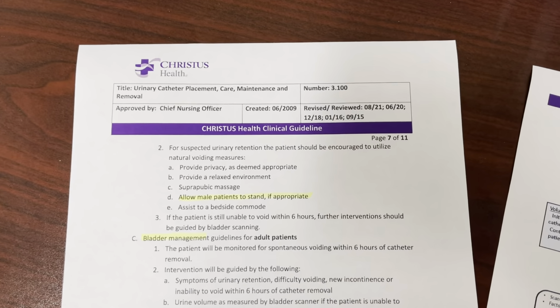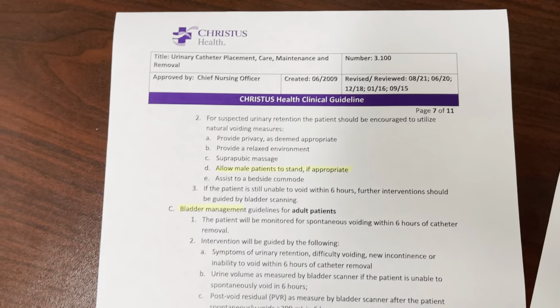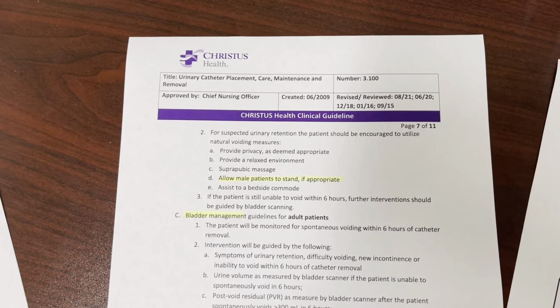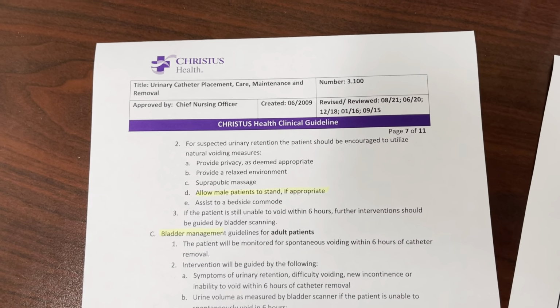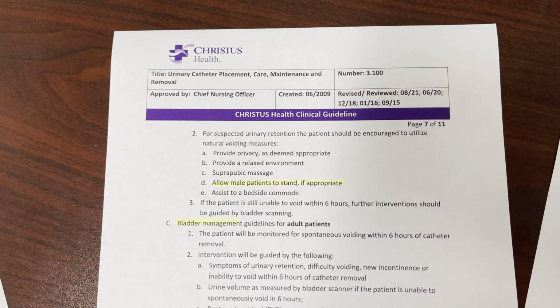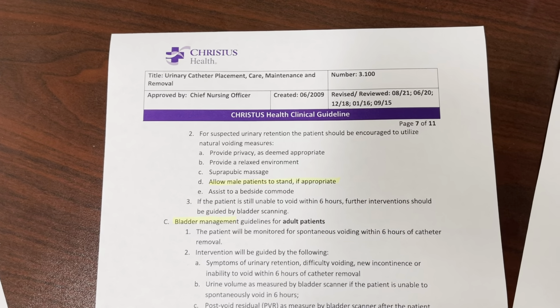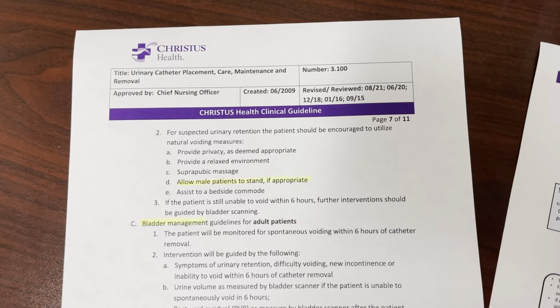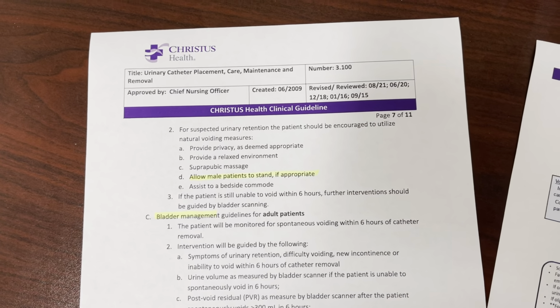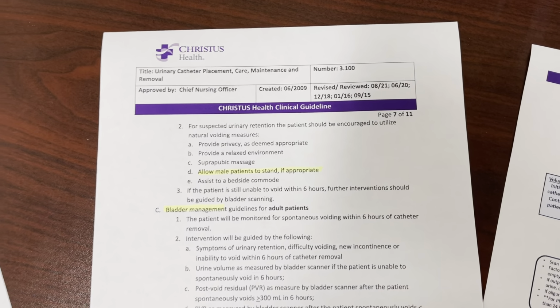Also, when you're looking for your patient to void, make sure that we're trying to create an environment that's going to be conducive for them to be successful. So a lot of times retention has to do with the muscles not being active for a long time. They have to sort of kick back in and get used to squeezing. Some of it can be positional. So if your patient is used to standing up to void, especially with male patients, and it's safe to let them do so, let them stand up to void so that they can get back into that habit and sort of kick those muscles back in.